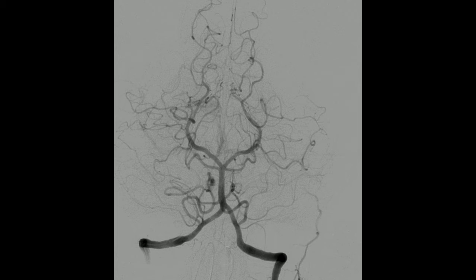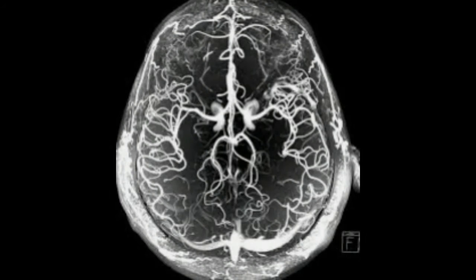Embolization, a minimally invasive surgical technique, over time has played an increasingly significant role in the multimodal treatment of cerebral MAVs, facilitating subsequent microsurgical or radiosurgical treatment. Another type of treatment possible by angiography, if the images reveal an aneurysm, is the introduction of metal coils through the catheter already in place and maneuvered to the site of aneurysm. Over time, these coils encourage formation of connective tissue at the site, strengthening the vessel walls.